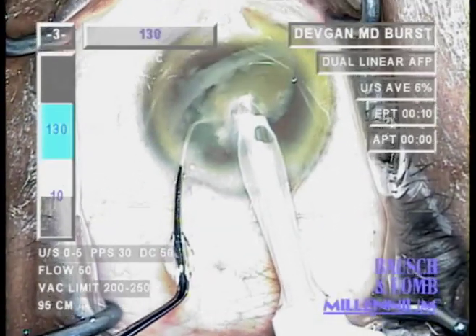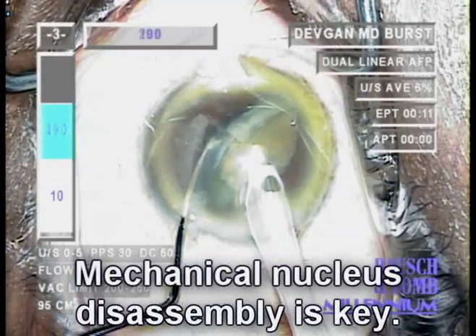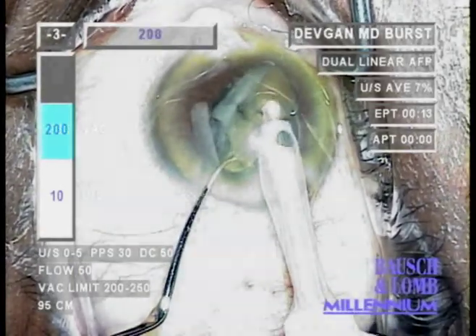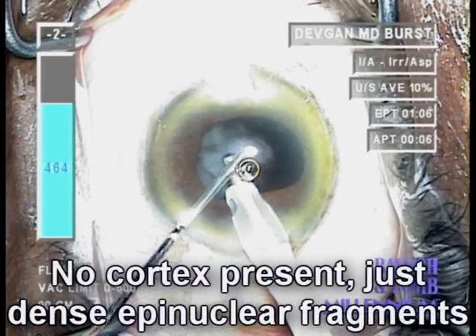Still, with time and patience and low power, we're able to remove the entire nucleus. We'll notice that this eye does not have much cortex — in fact, it has almost none. At the end of phaco, there are just epinuclear fragments that are present.